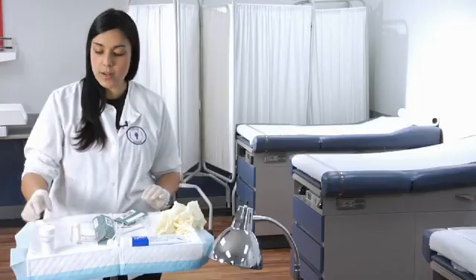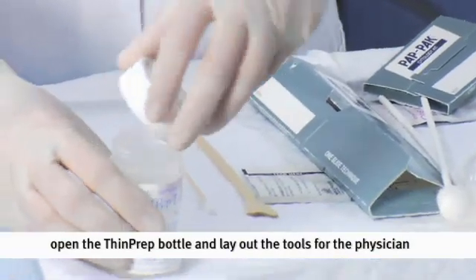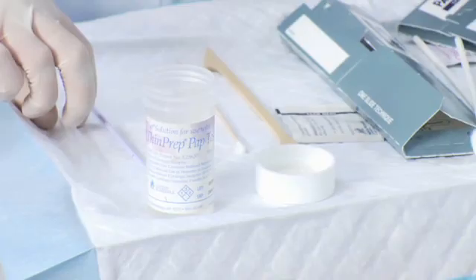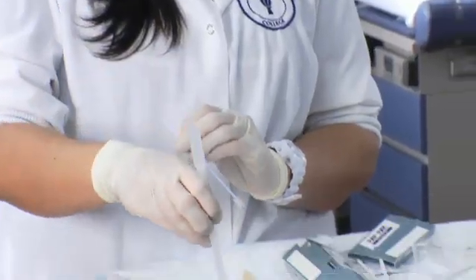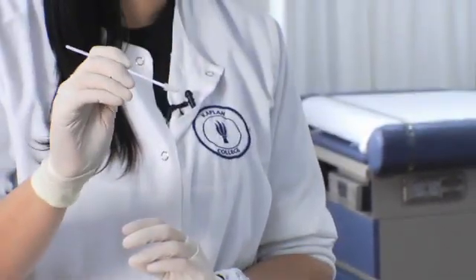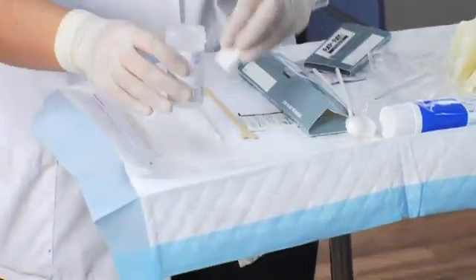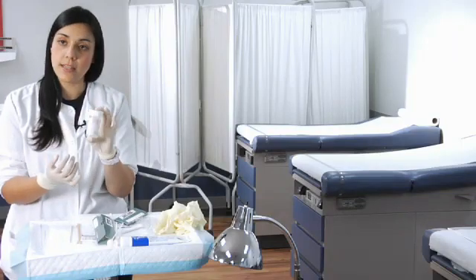The next type is the thin prep. Go ahead and uncap it and have it open for the doctor. Same concept as the pap pack — there is a little spatula that the physician will use to get the samples and mix them into the preservative. Grab a couple more samples, some secretions, mix them into the preservative, then cap it, put a label with the patient's information, and send it off to the lab.